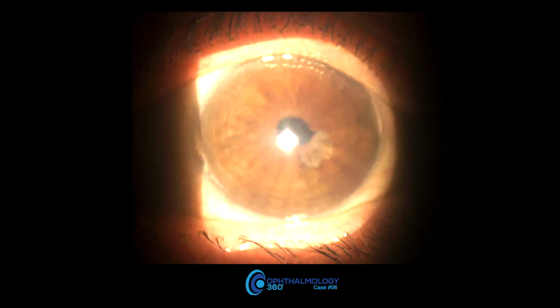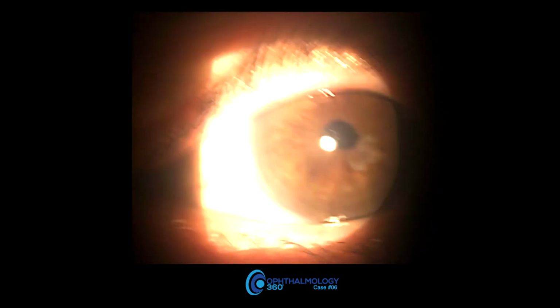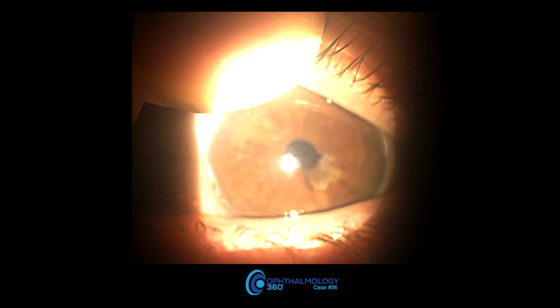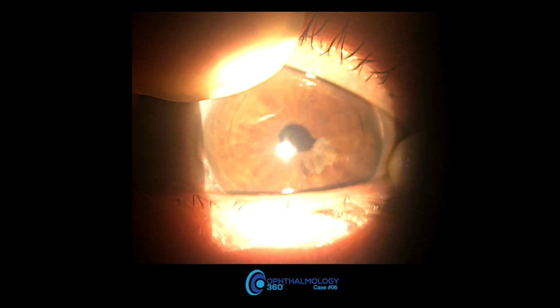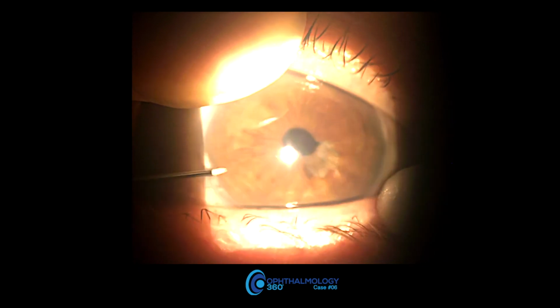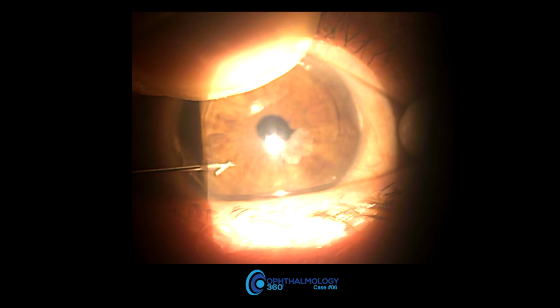So here we have a right eye, a pseudophakic patient. The patient had a pretty myotic pupil. You can see a little irregularity. So I'm really going to use my non-dominant hand. The patient's moving around a little bit. We're trying to get the upper lid stabilized. And if you just keep talking to the patient, patients are generally very nervous, and they will trust the surgeon.